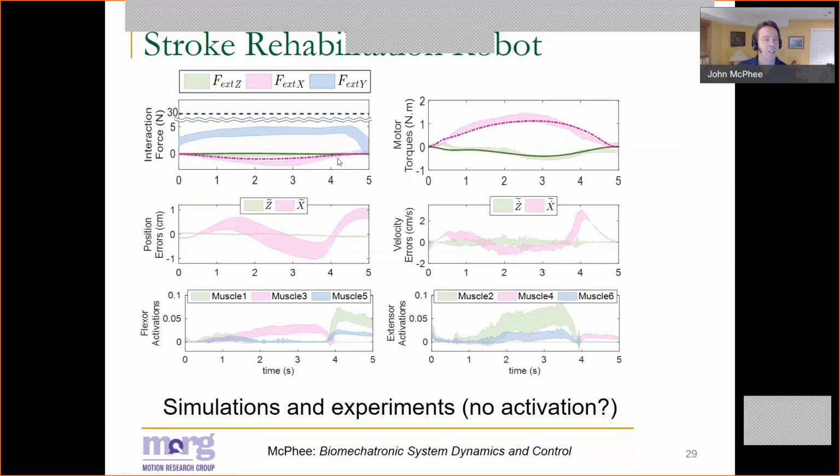Good tracking on the velocity target as well. However, when we look at the interaction forces, we get a good agreement within the plane. But in terms of that vertical force, we see that the user is in fact using their muscles. And instead of that full 30 Newton weight resting on the end effector, the user is supporting some of their load. And the force on the end effector in the vertical direction is much less.